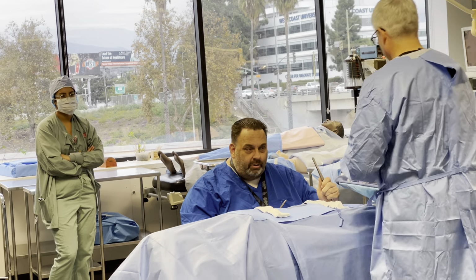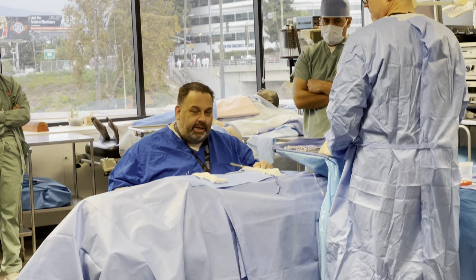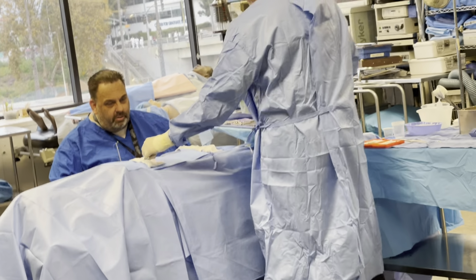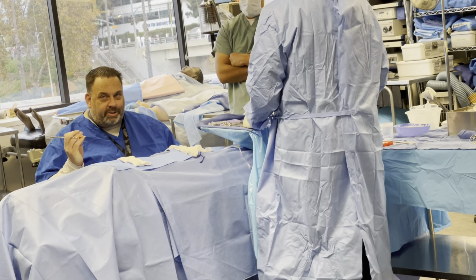1, 2 on field. 3, 4, 5. Anything up here is considered on the field, okay? And we count it the same way. We do these 2 count here, and then we do a drop count there. If that was on the floor, which is the kick bucket, right? You can't count that. We can count from the field to the Mayo stand to the back table. So go ahead and count again. Laps. We got 1, 2 on the field. 3, 4. Who counts the one on the field? That's okay. Circulator, come along and say, here's one more, 5.